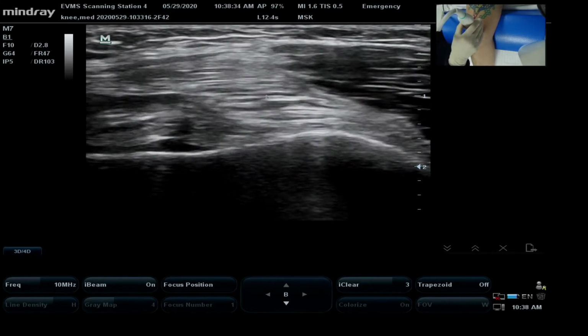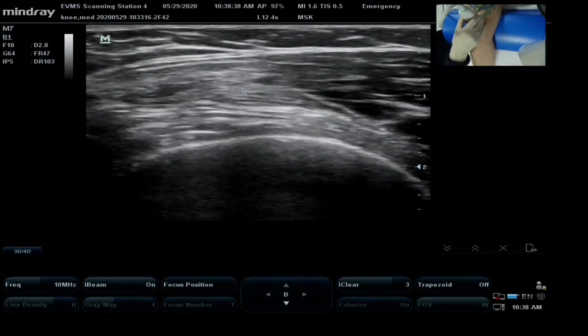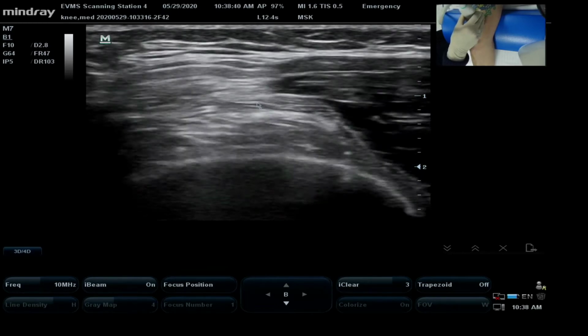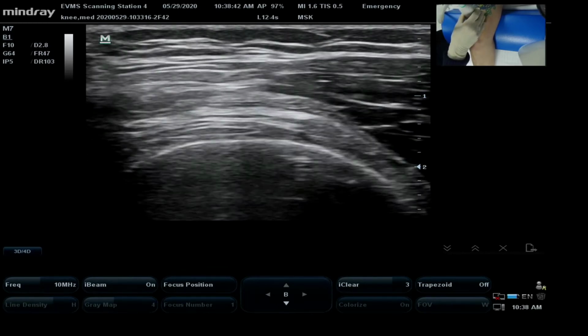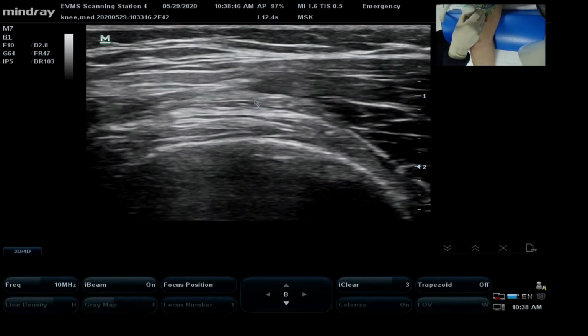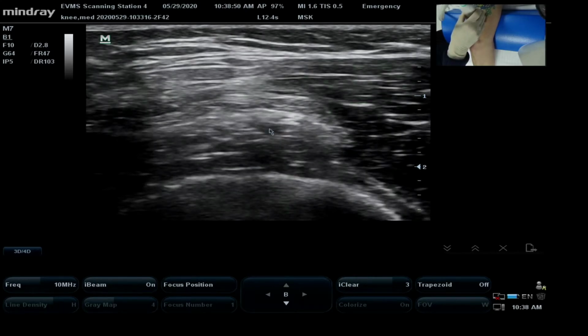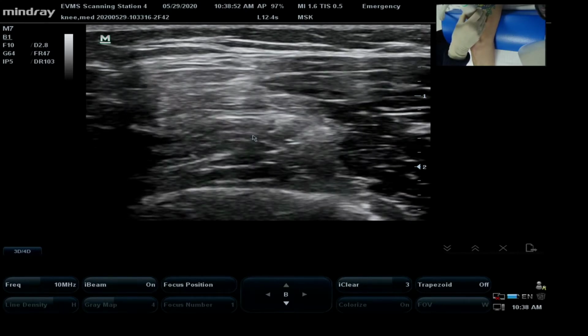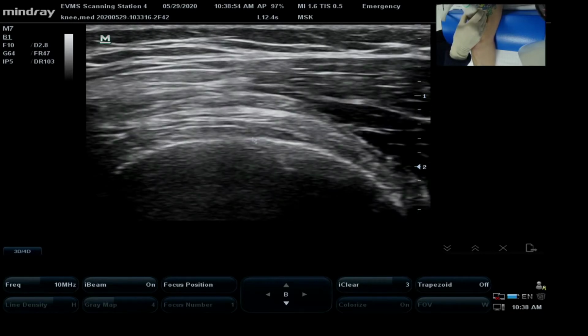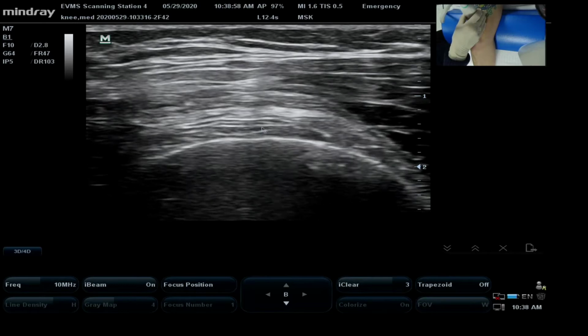And I'm going to put my cursor on it, and I'm going to follow this tendon all the way up. Our patient is clenching her muscles there. You can see them clench. Here's our tendon here. So what we're seeing, do that again. We see that one really tighten up, that's deep. Go ahead and relax. That's intermedius. So that's the one muscle that we don't see when we're looking at topography.